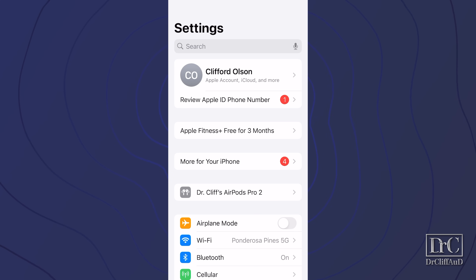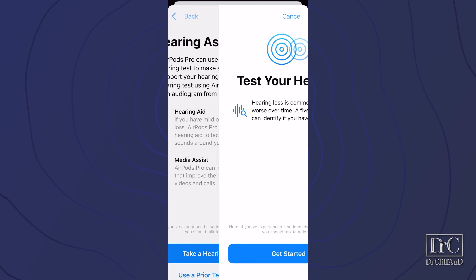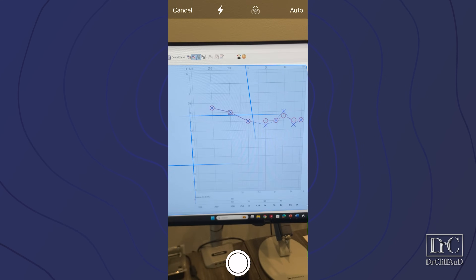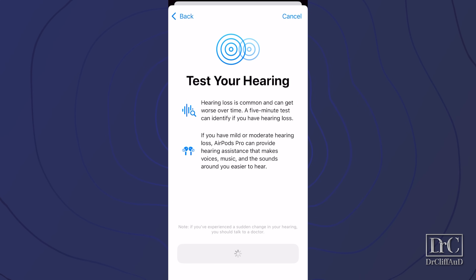When the update occurs, you will eventually see the hearing health section appear in the AirPods settings. When you do, you have a few options for adding an audiogram, which will customize your amplification levels. You can either take a hearing test in the app, take a photo of a professional audiogram, or enter your professional audiogram results manually. Let's start with taking a hearing test inside of the app.